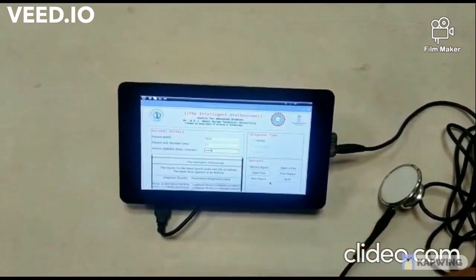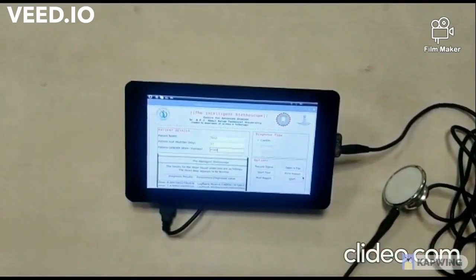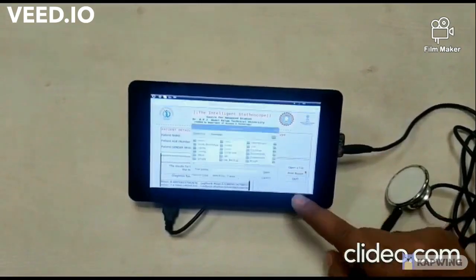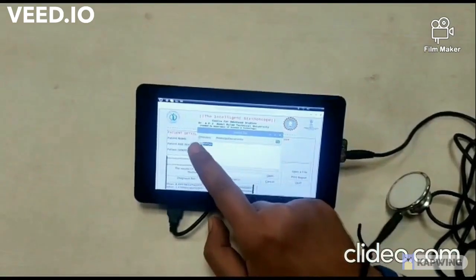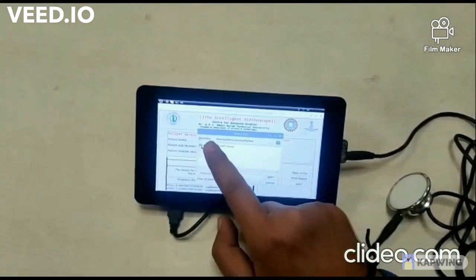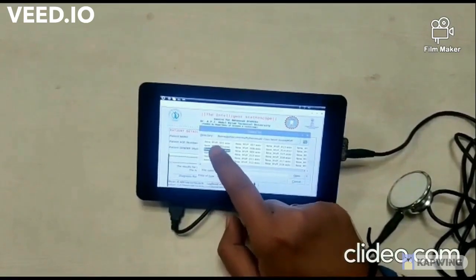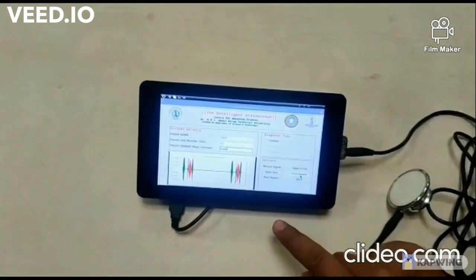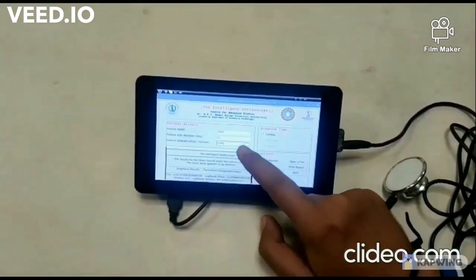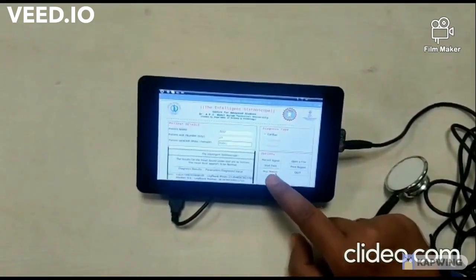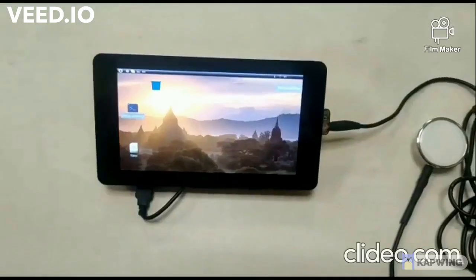Click on mail report to mail the generated report. Click on print report to print the report using a Wi-Fi connected printer. Click on open a file to open an already recorded heart signal — the recorded signal will be displayed on the GUI. Click on start test to view the reports. Click on mail report, click on print report. The user can then quit.